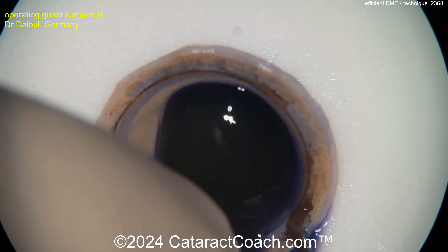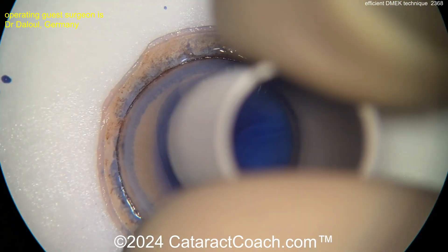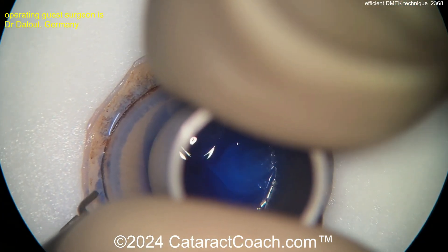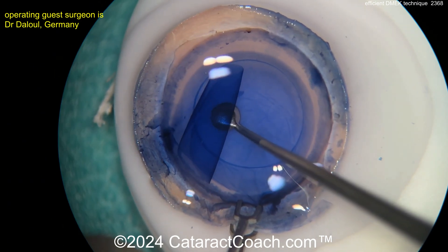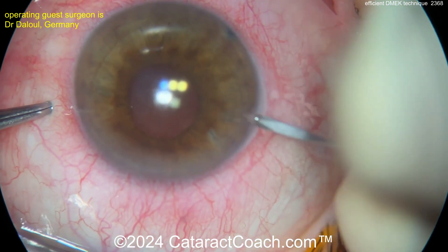The surgery involves preparing the graft and injecting to separate out that layer with Trypan Blue Dye. Now here's the trephine. This is a lot more work than the way I'm used to — I'm lucky with how I get it. Here's the graft, nice and easy getting that out. Make sure you're aware of how it's curled up.